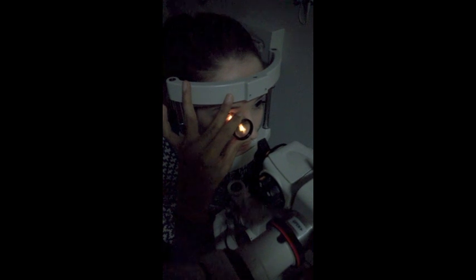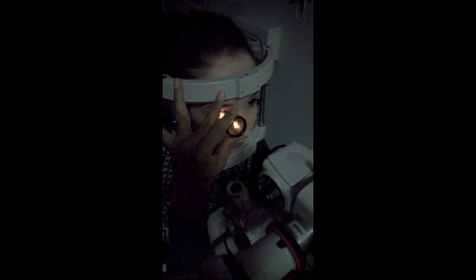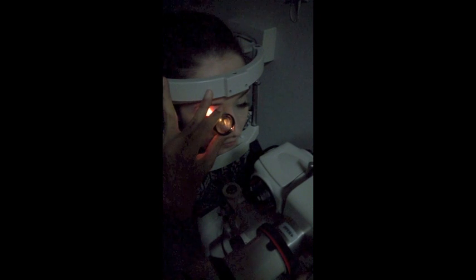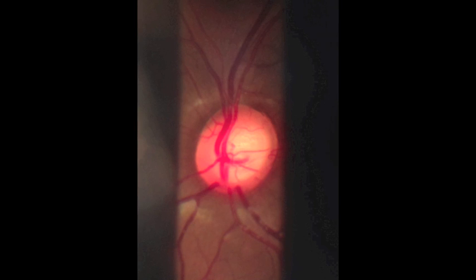Position yourself by looking around the side of the slit lamp and make sure that the light is passing through the lens. When you are in position, look down the eyepieces and slowly pull the slit lamp back by around 2 inches. You should start to see the optic disc coming into focus. It should look something like this.